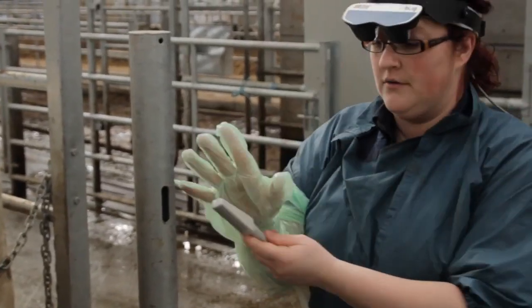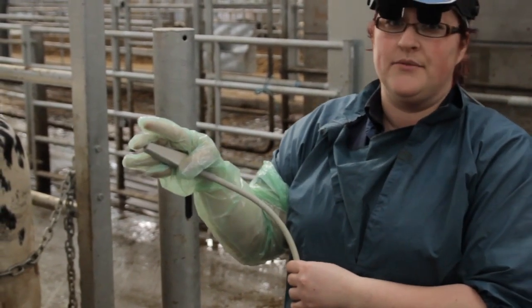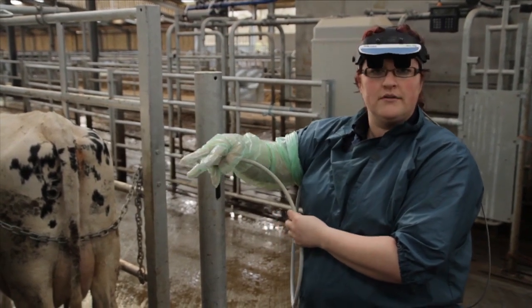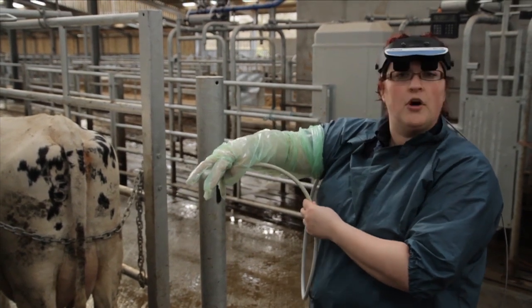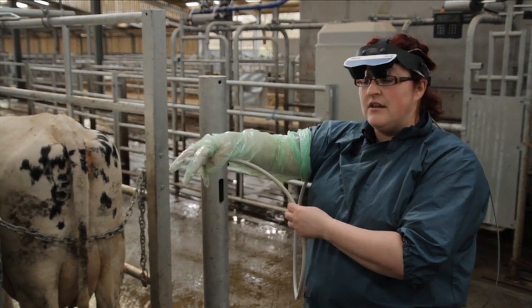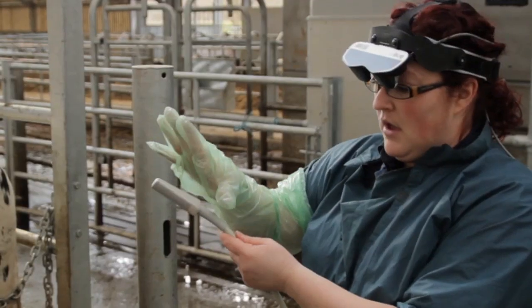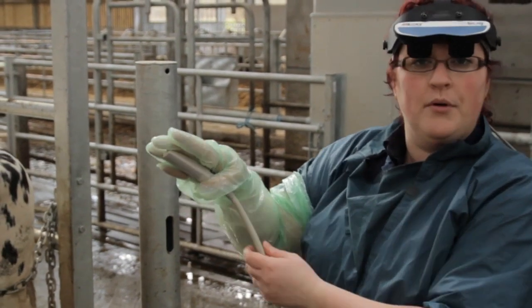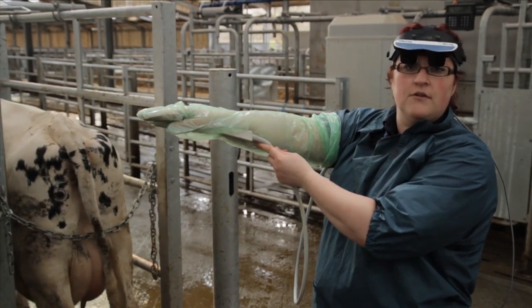So if we have one finger on the leading edge of the probe, then we know where we are at all times. We then have several fingers on either side that can help us orientate where we are within the cow. So whether we're on top of the uterus or on top of the ovaries, it gives us an idea of where we're actually located. You can use your thumb as a backstop to the back of the probe. This will help us as we're moving inside the cow to ensure that the probe doesn't travel back down our arm.